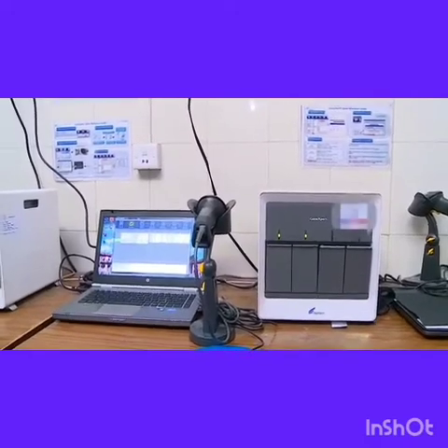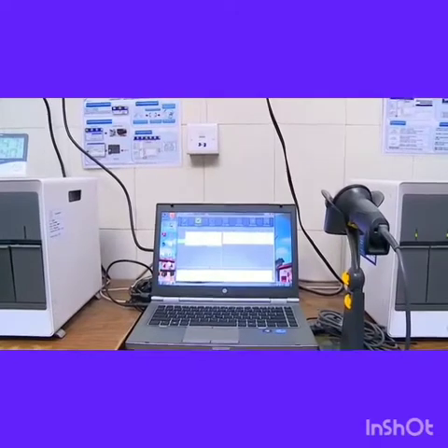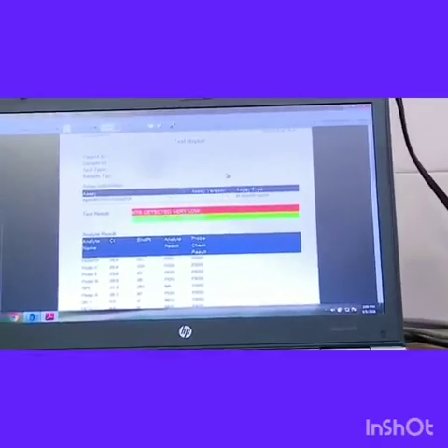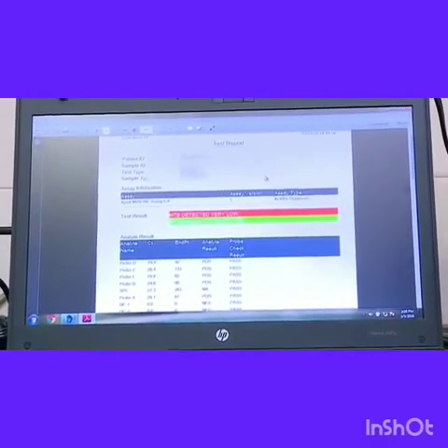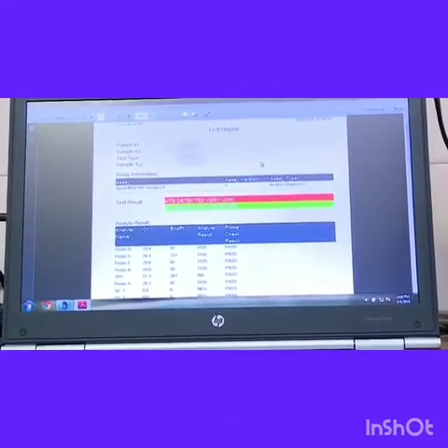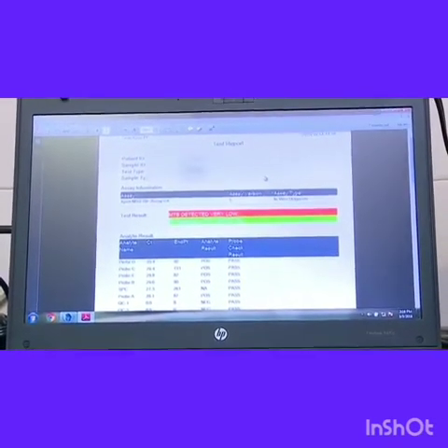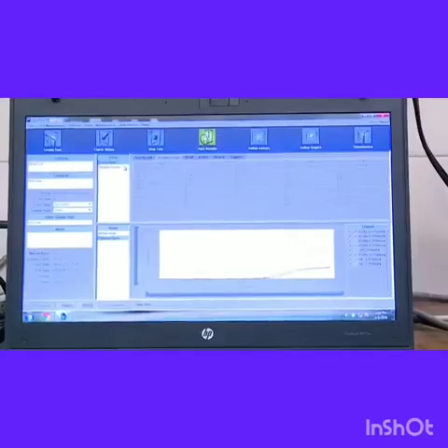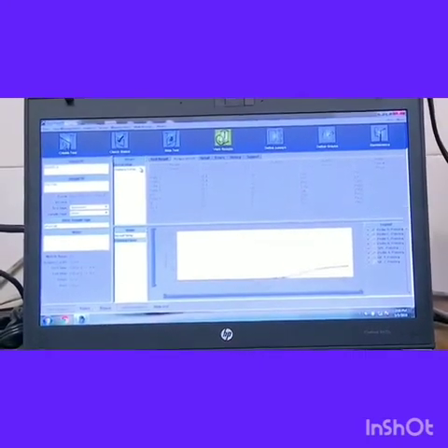At the end of the run, which is about 90 minutes, the results are displayed. In this case, MTB is detected with a very low bacterial count and rifampicin resistance is not detected. The result can be printed as such, or the results can be visualized in graphical form to check whether the probes have been working.